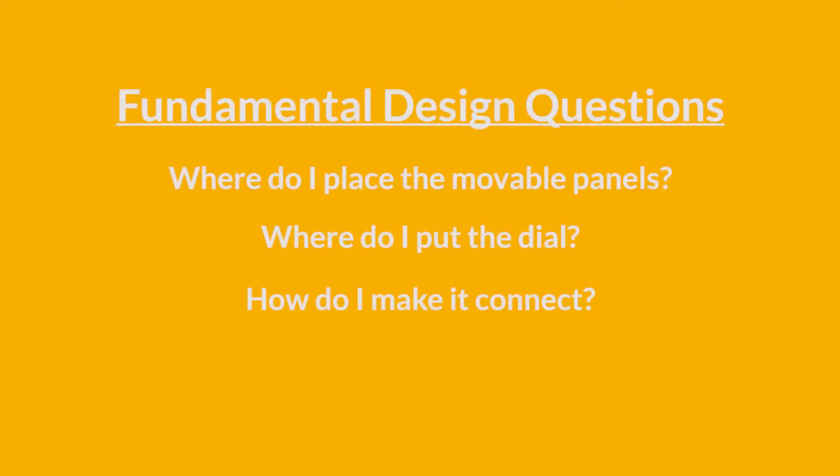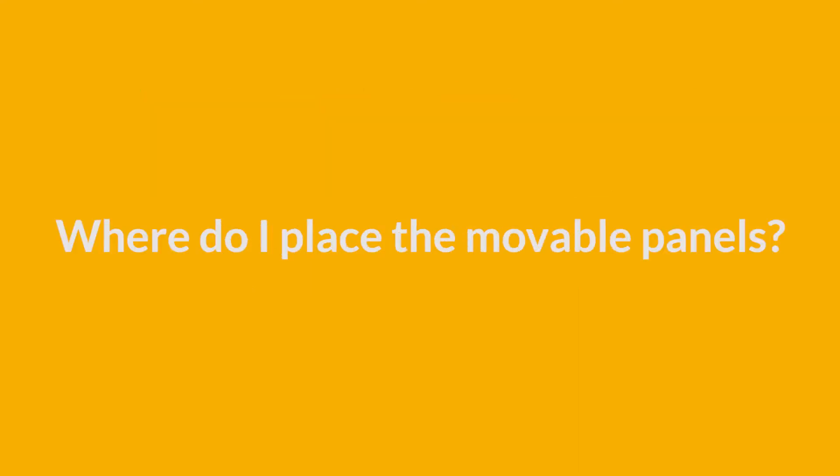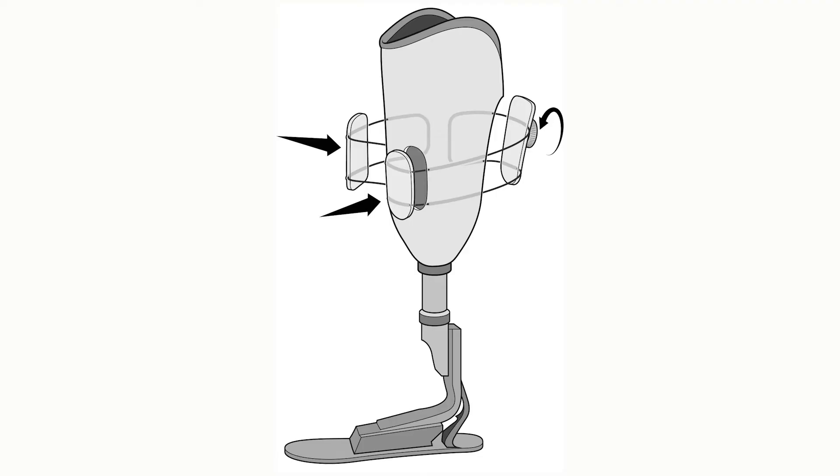Before we start, let's go back to the fundamental design questions. Where do I place the movable panels? Remember, the basic three-panel design we talked about in the last video positions pads on either side of the tibia, and on the gastroc area. This design allows for adjustability in overall fit, without transferring any pressure to the distal tibia.